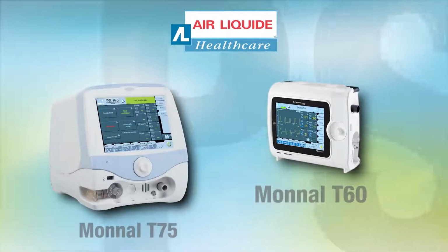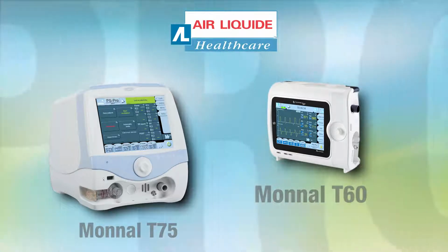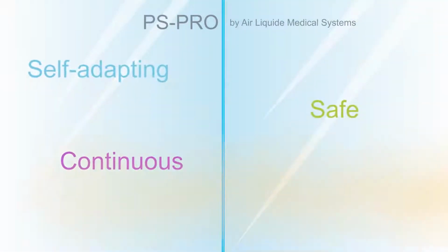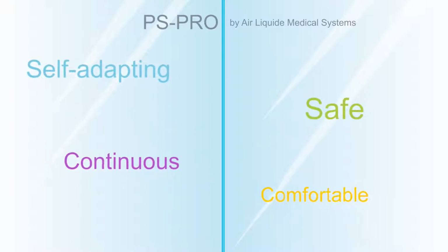PS Pro, a self-adapting mode for patient recovery. PS Pro is a unique mode specifically designed to assist patient recovery. Its self-adapting behavior offers safe, continuous, and comfortable ventilation. Using PS Pro, medical staff are free to focus more on delivering care to the patient.